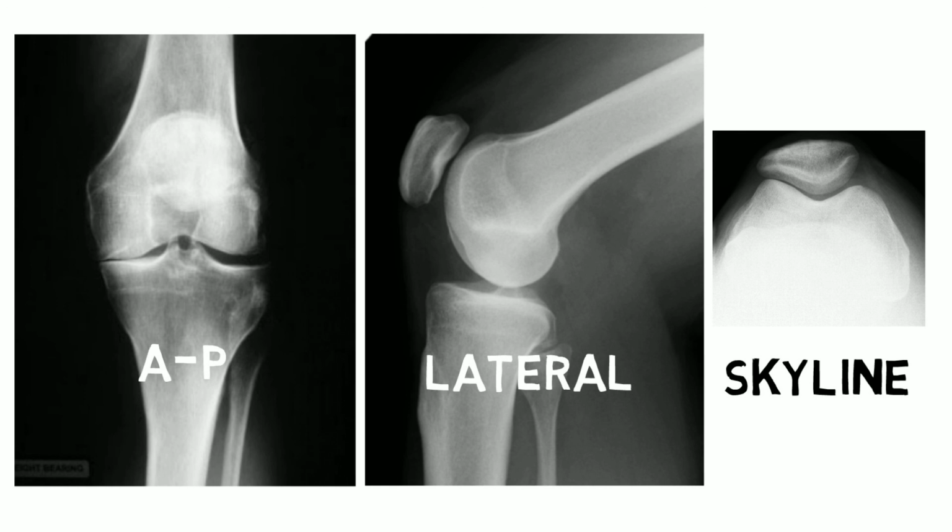Well, that's the end of this part. This particular presentation is only short, but nonetheless, the skyline view is really important.